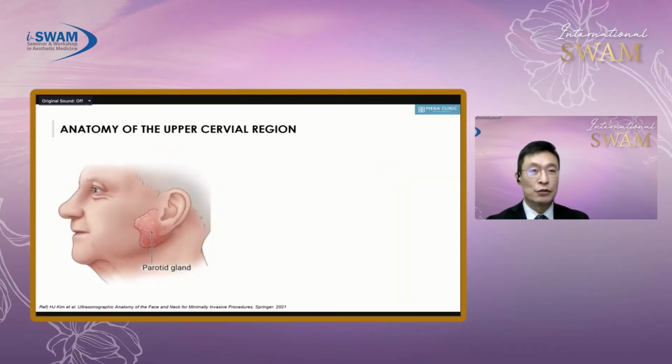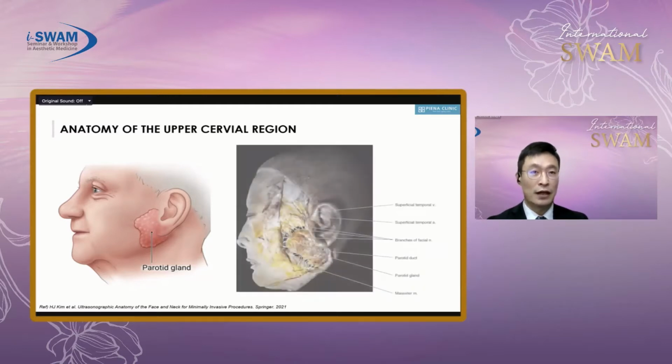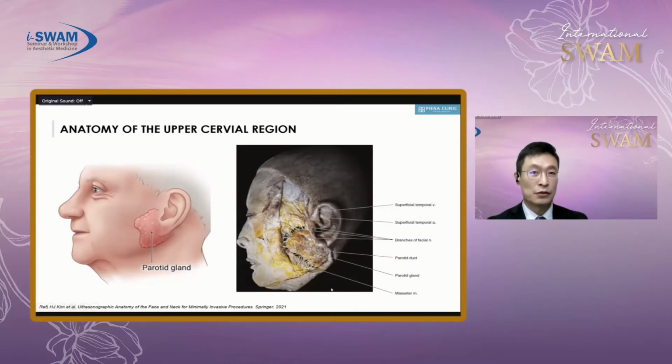When lifting the lower face, we should also be aware of the precise location of the parotid gland. The parotid gland is the biggest major salivary gland, and the tail part is the most inferior portion of the superficial lobe. It is triangular shaped, located deep to the platysma muscle, below the mandibular border. So it may be damaged when lifting the lower face or submental area using threads. If an inflammation of the gland occurs due to deeply inserted threads, it may cause a severe complication, so more careful attention is required when performing these procedures.